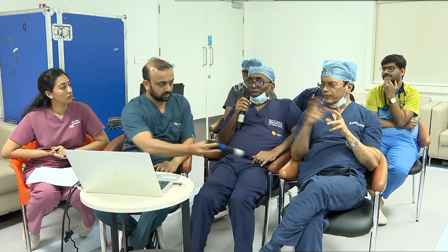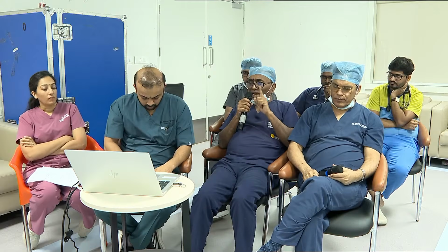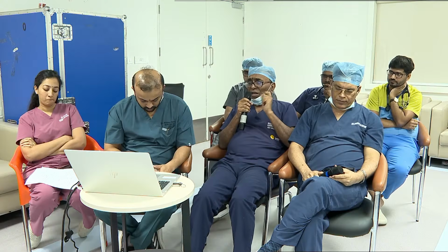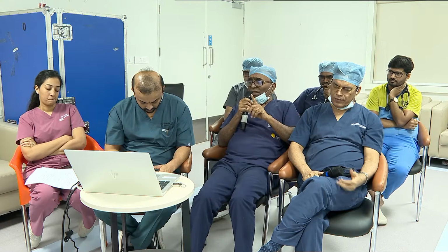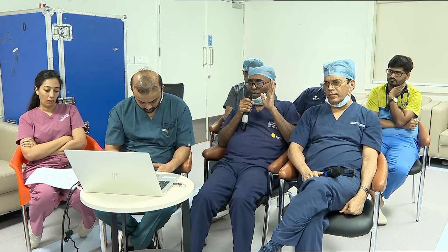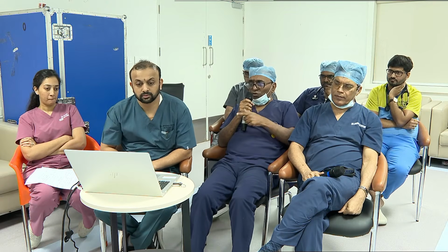See, in case of a TAVR, the most important aspect is the CT analysis and choosing the right valve. That will take care of 90% of the care. The rest of the procedure is only 10%. Here, the most important thing, I will start from the beginning. The common femoral artery, which is the site of puncture, should be at least 5 millimeters, because we are using a 14 French Python sheath for this. The size of the common femoral artery should be at least 5 millimeters. That is the first and foremost thing.